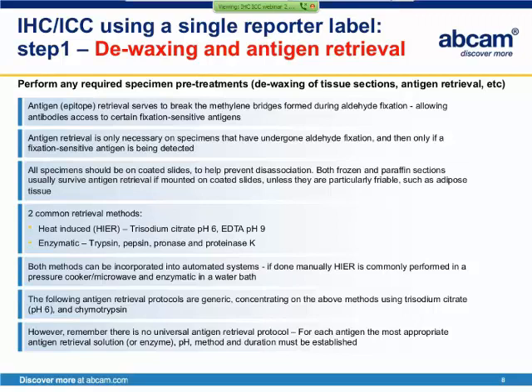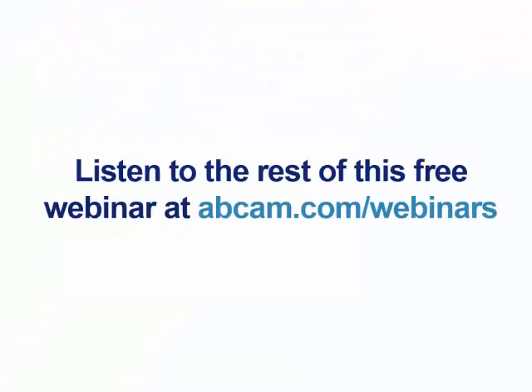However, please remember that there is no universal antigen retrieval solution. For each antigen, the most appropriate antigen retrieval solution, or enzyme, pH, method and duration must be established.